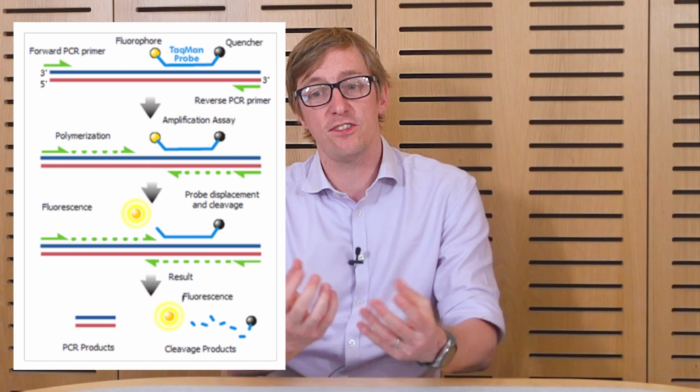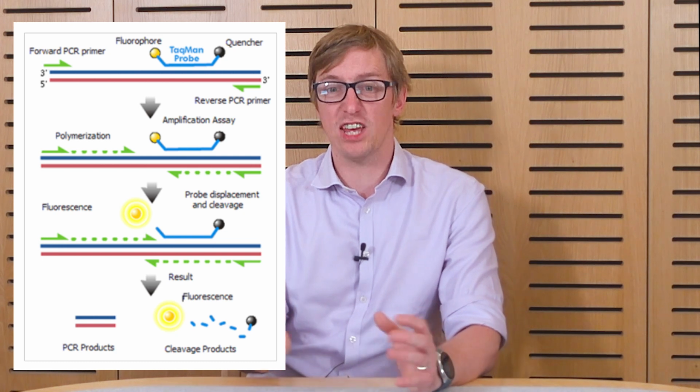But once you've done that, what we do is we get that RNA and we turn it back into DNA. So we re-photocopy it into DNA, which is much more stable. And then we run what we call an RT-qPCR, which is essentially a way of monitoring very accurately the amount of BCR-ABL. And I don't want to go into too much detail here, but essentially it's the same as the polymerase chain reaction we've just talked about.